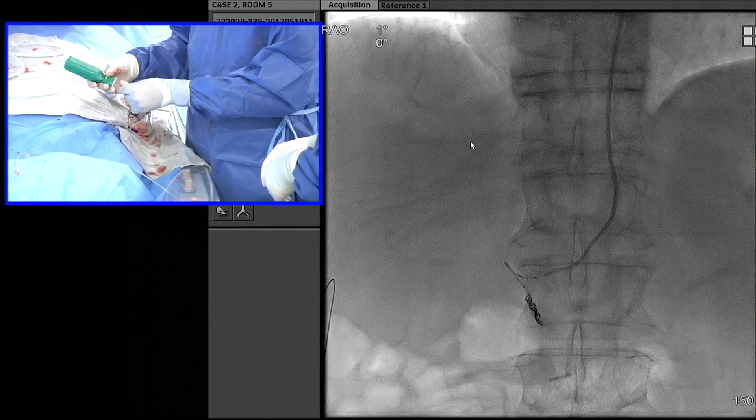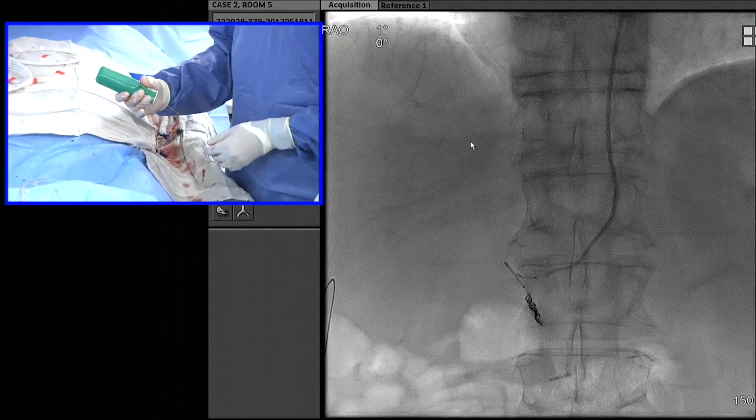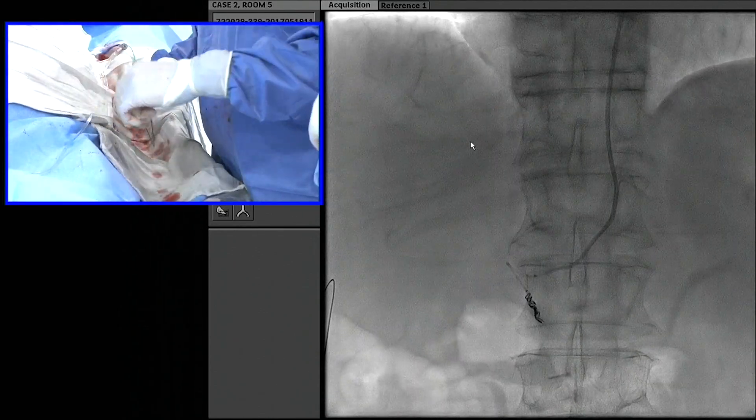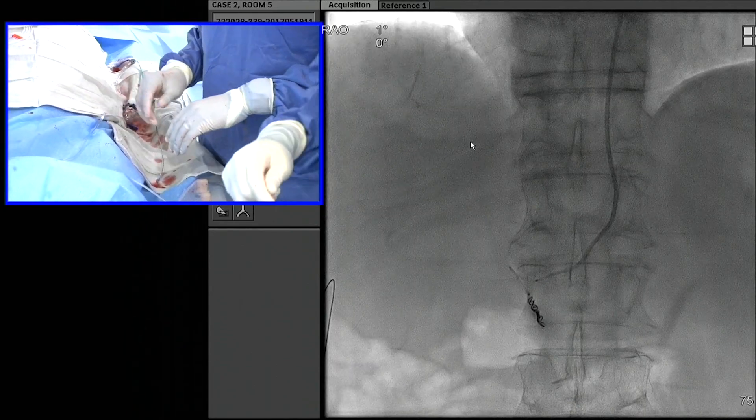These coils have hydrogel on the inside, so they eventually expand a little bit and swell. I'm not going to really force the issue here — it should actually occlude pretty well. It should be enough.